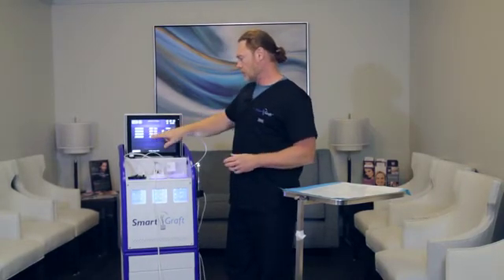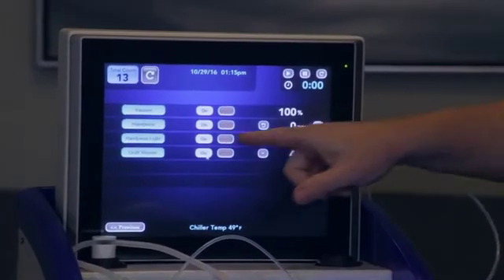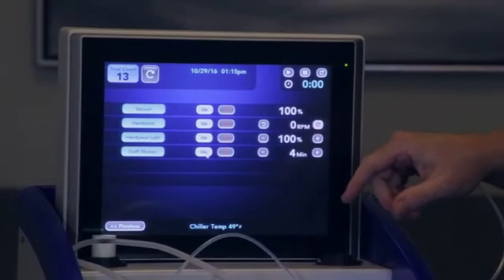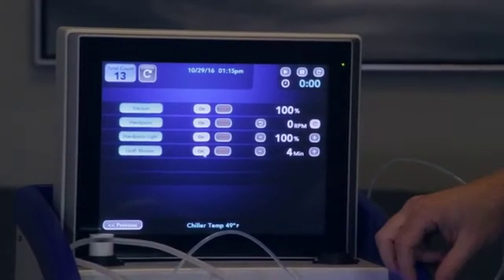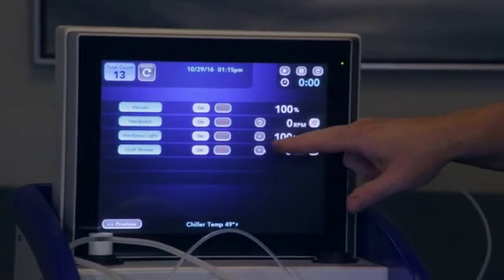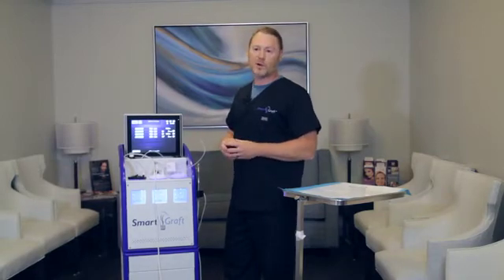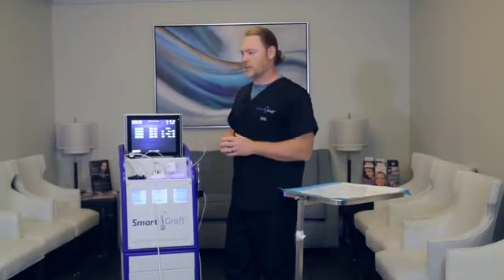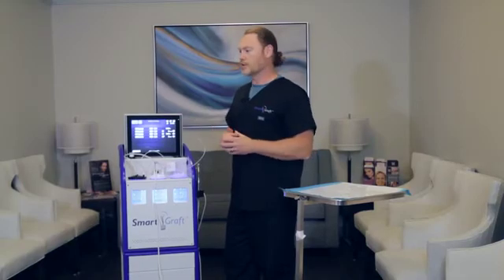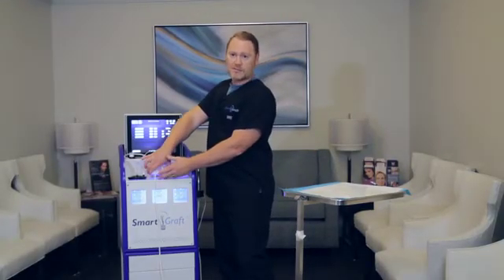The last one is actually the graft shower. You want to hit that on button. You can change the amount of time between rinsings of the grafts, which is a simple depression of these buttons for more or less. Most people opt to use between four and five minutes. Just keep in mind the more that you shower them, the more saline is going to go in here, so you really just need to pay attention to how much saline goes into this.